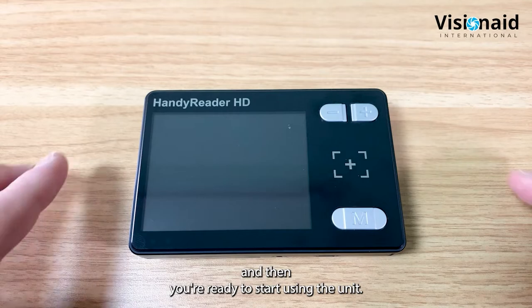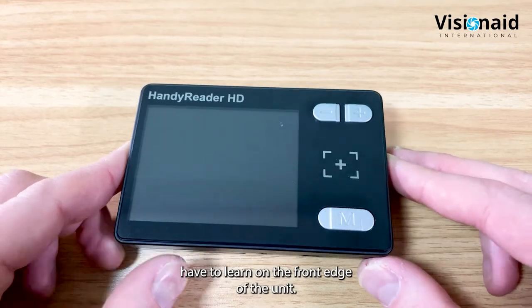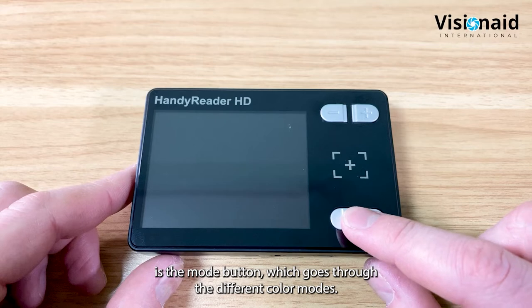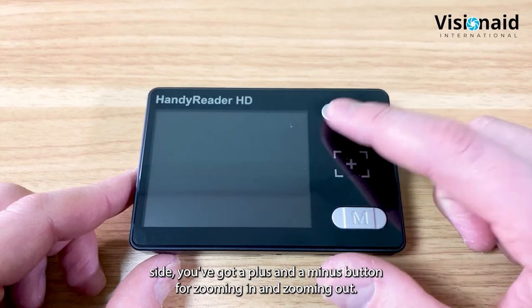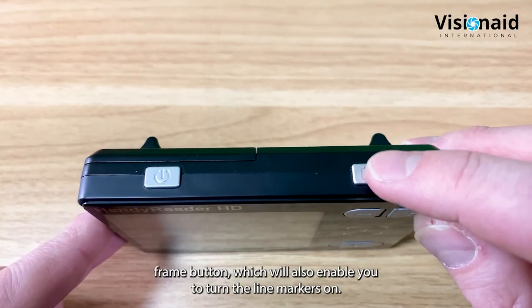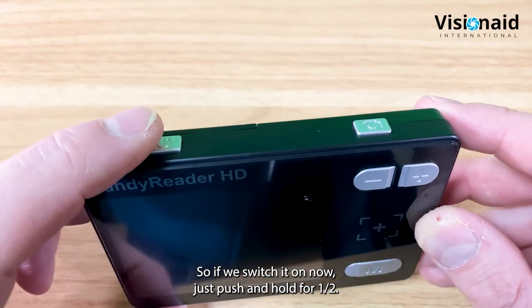There are five buttons in total on the Handy Reader HD. On the front right edge: the mode button at the bottom right cycles through color modes, with plus and minus buttons above for zooming in and out. On the top edge: a freeze frame button that also enables line markers. On the left edge: the on/off button - push and hold for one second to switch on.